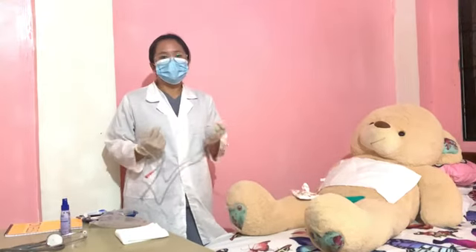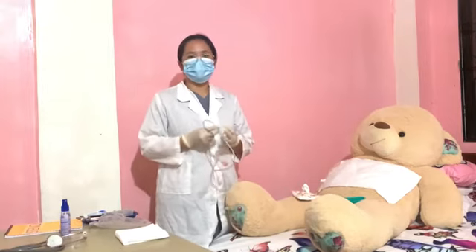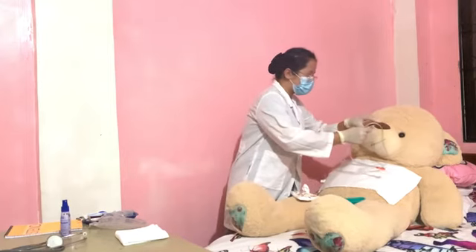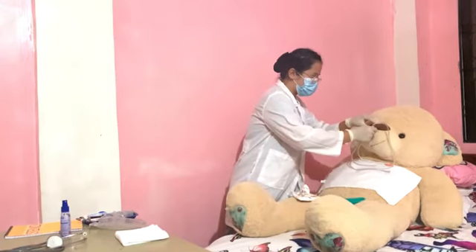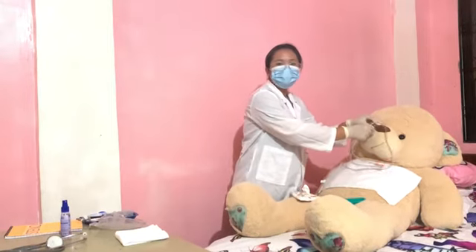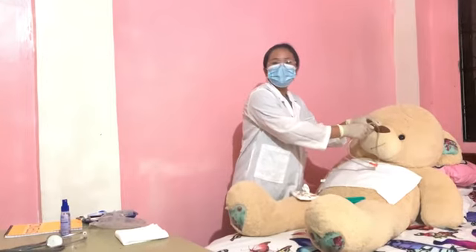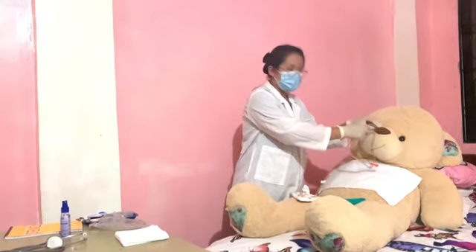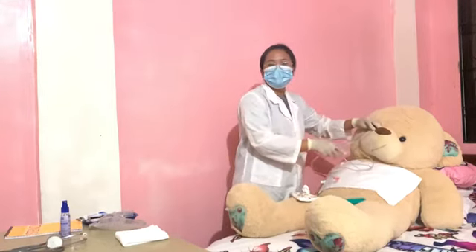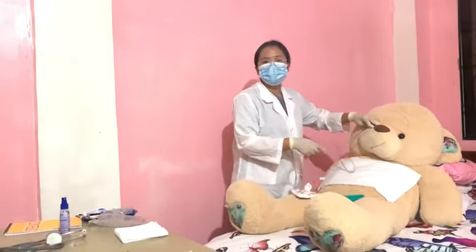And then gently insert the tube into the nostril while directing the tube upward and backward along the floor of the nose. Ma'am, insert po ako ma'am ha. Thank you. And then, the patient may gag when the tube reaches the pharynx. So, provide tissue for tearing or watering of the eyes. And then offer comfort and reassurance to the patient.